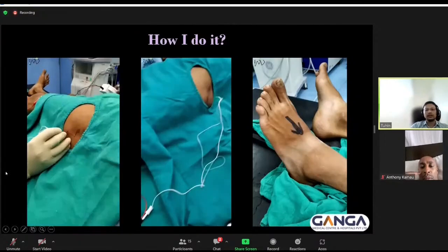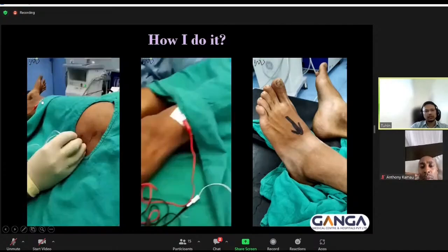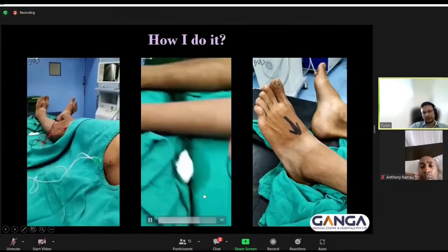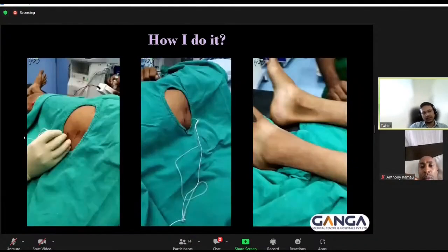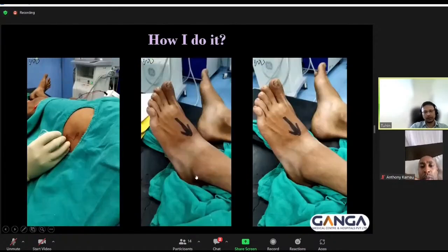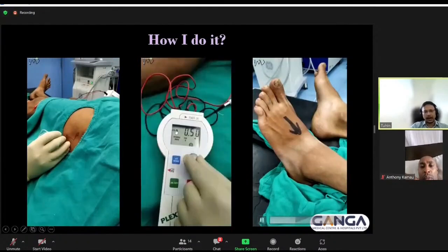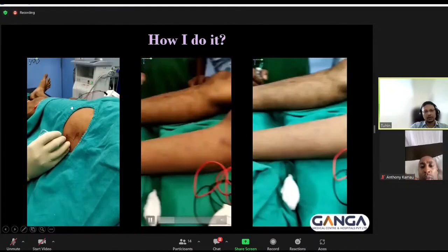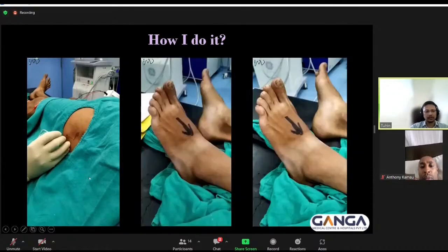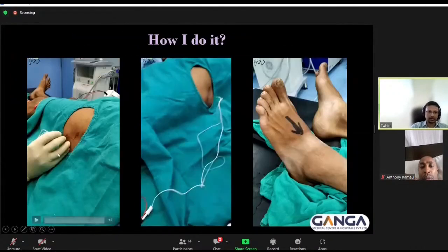As the needle is entering from the lateral side, usually we will get either eversion or dorsiflexion because it is expected to stimulate the common peroneal component. So that's why we'll get either dorsiflexion or, at proximal level, the common peroneal response is acceptable. So we will accept this response and inject the drug here. If you are hitting the femur, then you just have to withdraw the needle and go a little bit posteriorly, that is 20 to 30 degree posteriorly.